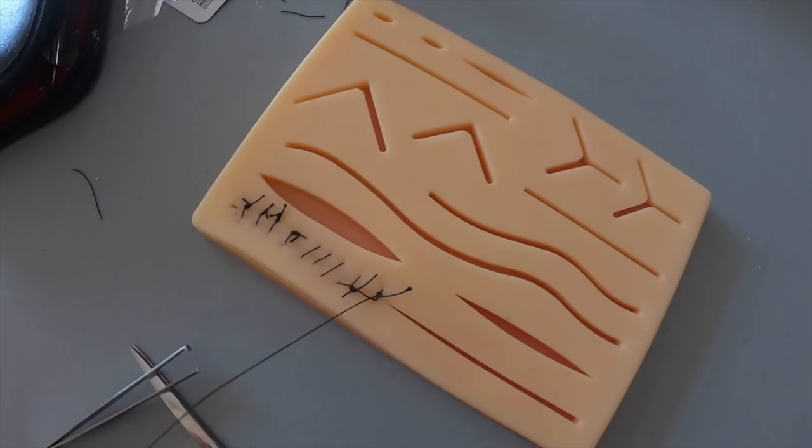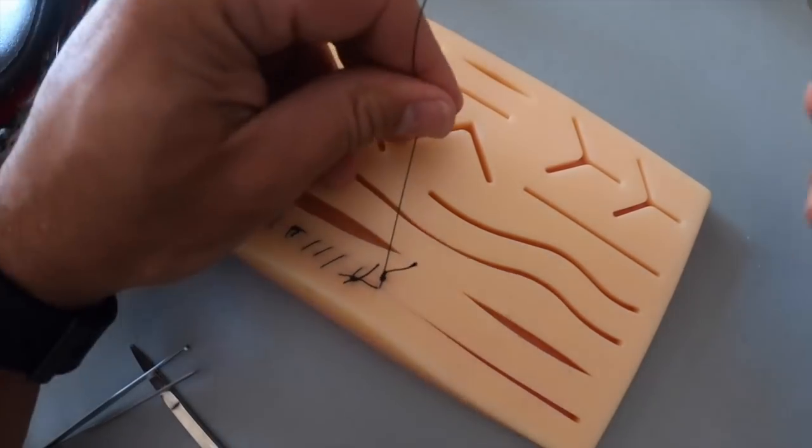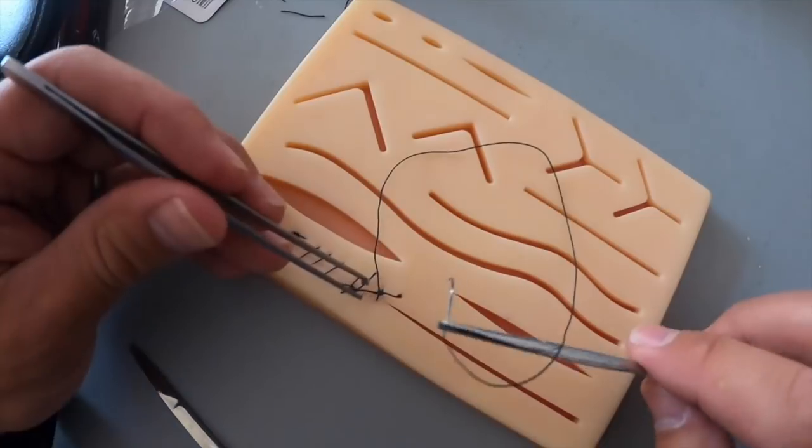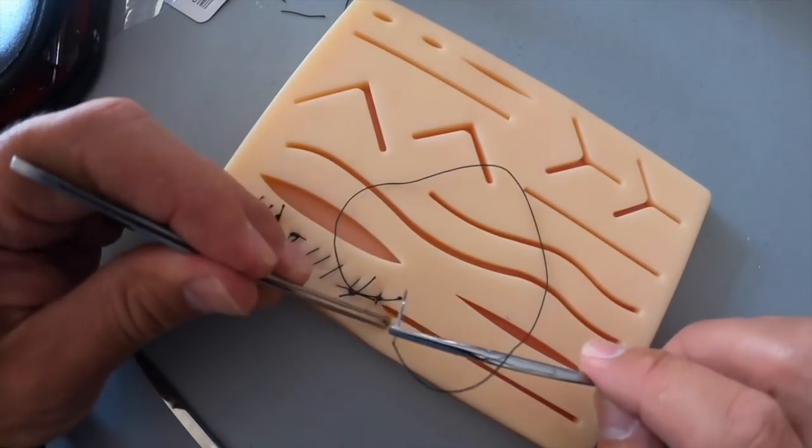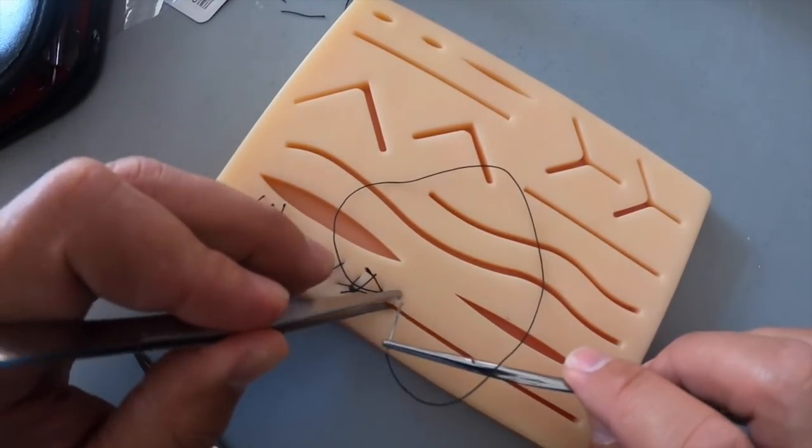All right, this is kind of a short thread so we don't have to cut that one. This is where it gets cool, so you're going to be just like before, you go in the wound and through it. It's getting a little tight here but we're still going to go through.